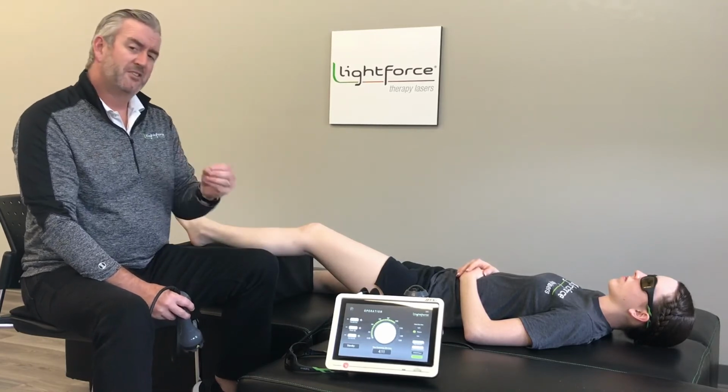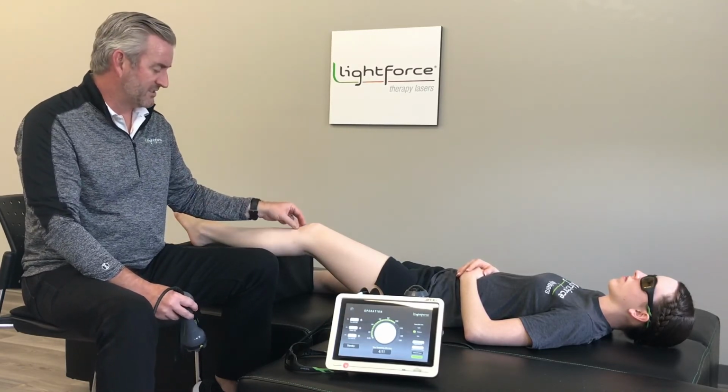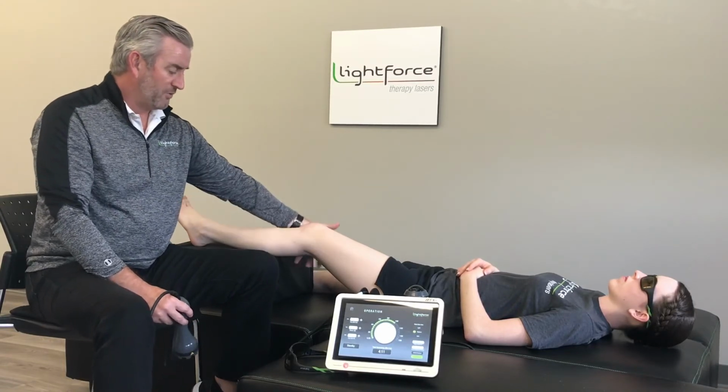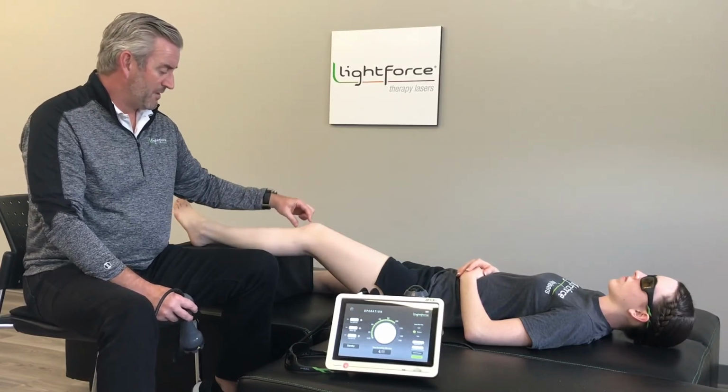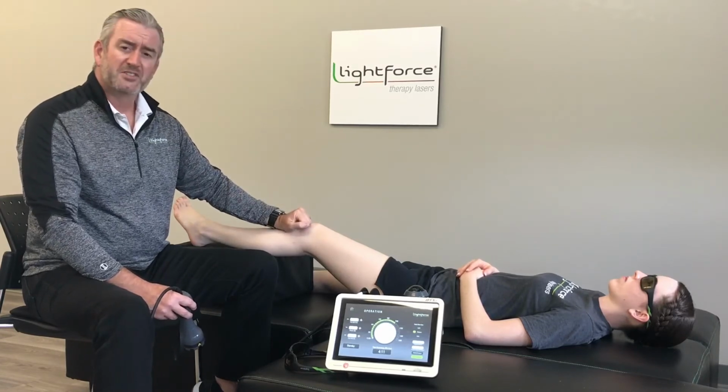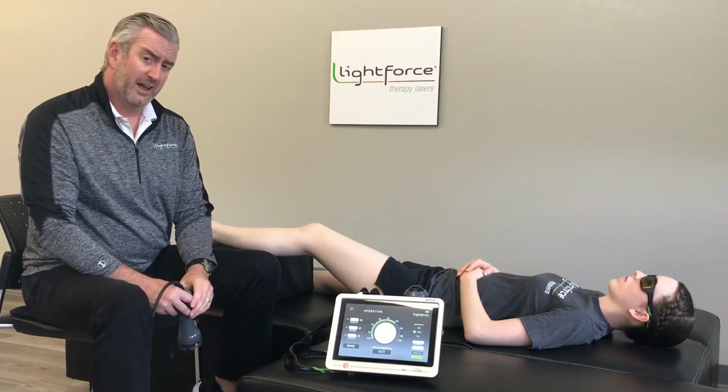In cases where you have a very specific pathology like patellar tendonitis or maybe a bicep tendon issue and you know that the area is quite a bit smaller, you would just adjust your calculation. So in this case, we're trying to treat all the way around the knee, so that's where our number of 500 centimeters squared comes in because we're trying to address the synovium. But if I was just trying to address the patellar tendon, and if this was 100 centimeters squared, that area would be quite a bit smaller. It might be 1/3 of that. So your area would be smaller, and treatment time is going to go way down. So don't be afraid, if you really are treating something specific, to really zero in on that tissue and treat that locally and see what the response is before you start to treat other areas.